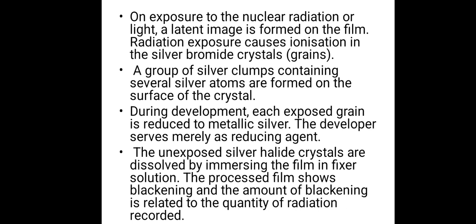During development, each exposed grain is reduced to metallic silver. The developer serves as a reducing agent. The unexposed silver halide crystals are dissolved by immersing the film in fixing solution. The processed film shows blackening, and the amount of blackening is related to the quantity of radiation recorded.